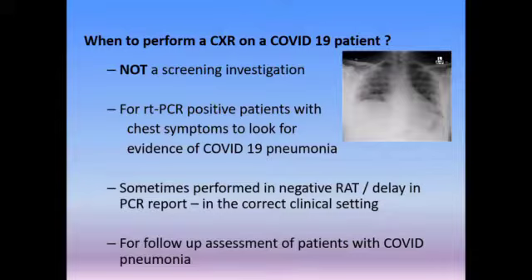So, in COVID-19 patients, when do we perform a basic chest X-ray? I must say that we do not use it as a screening investigation, because chest X-ray findings are not specific for COVID-19. It is a viral pneumonia, and the imaging gives us an appearance that is suggestive of a viral pneumonia, and therefore just by looking at a chest X-ray you cannot 100% say this is COVID or non-COVID. However, there is a certain pattern of involvement which may suggest that this is a developing COVID pneumonia.